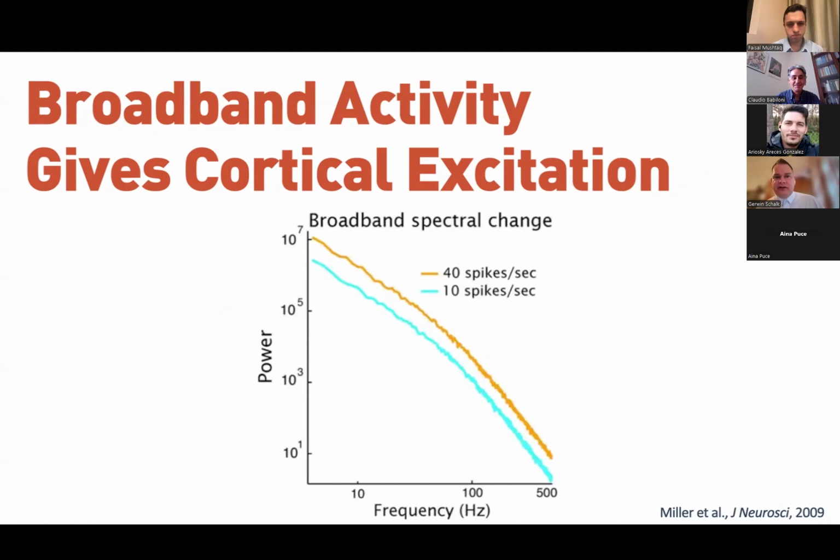Now, the second signal that we can see, and that we can only see in electrocorticography and not in the EEG, is the broadband spectral change. Brad has also talked about this, citing important work from Kai Miller and others, about how there's really a 1/f function in the EEG, and that reflects local cortical activation, the cortical excitation.